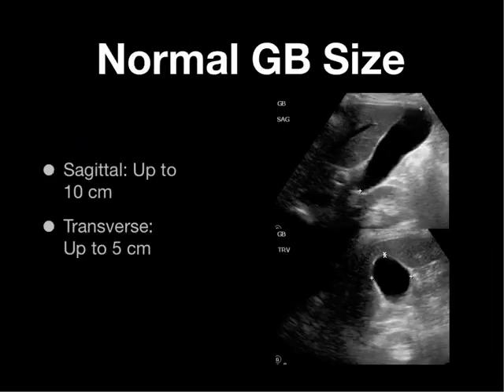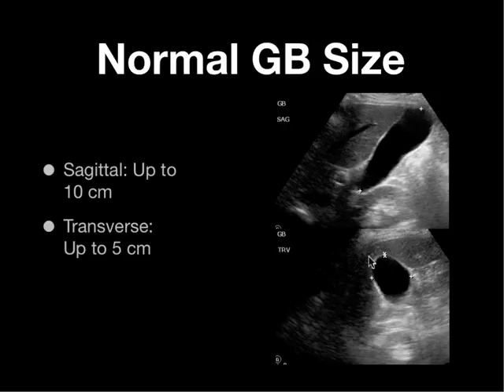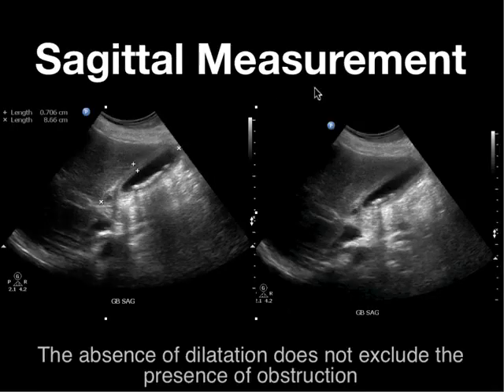Does size matter? Yes. A gallbladder with a transverse diameter, outer wall to outer wall, greater than 4 to 5 centimeters should raise your suspicion of cholecystitis. Sagittally, the gallbladder should be less than 10 centimeters, however this number does not correlate as well as the transverse width measurement. But here's a caveat: the absence of dilatation does not exclude the presence of obstruction, particularly early on in the timeline.